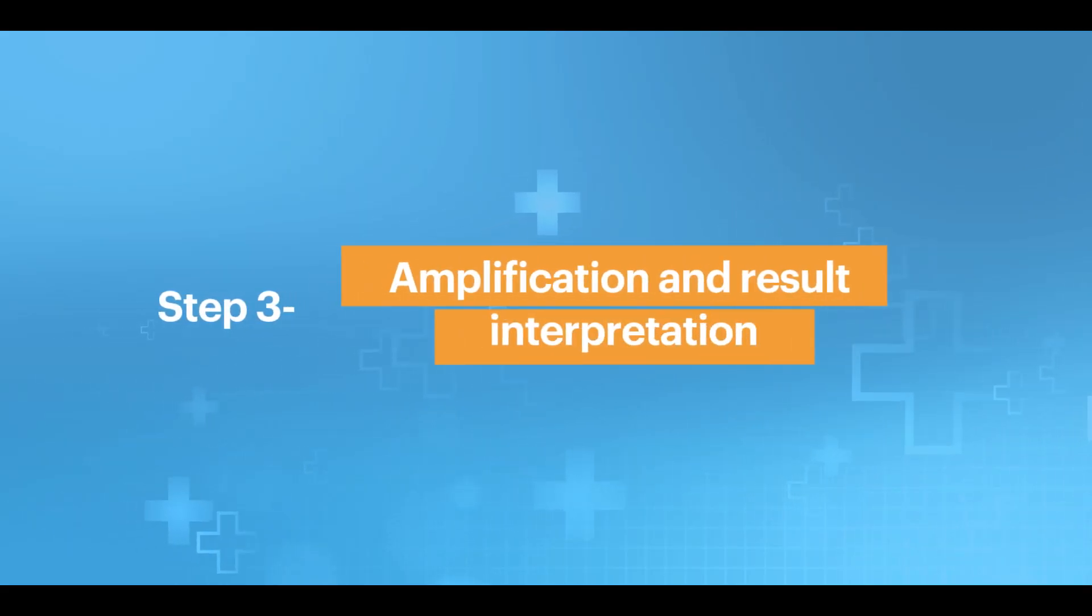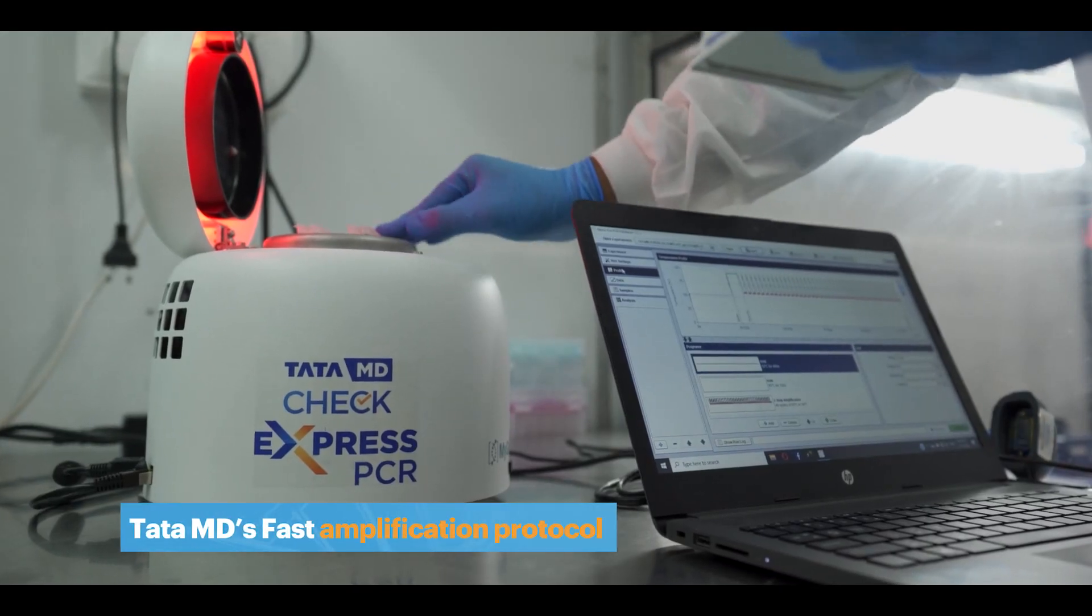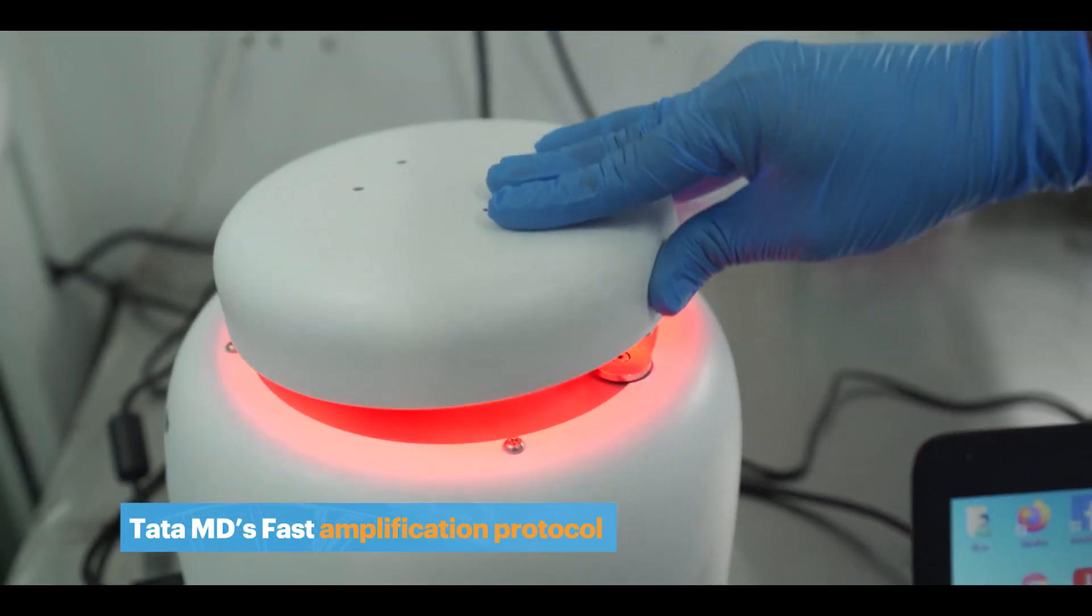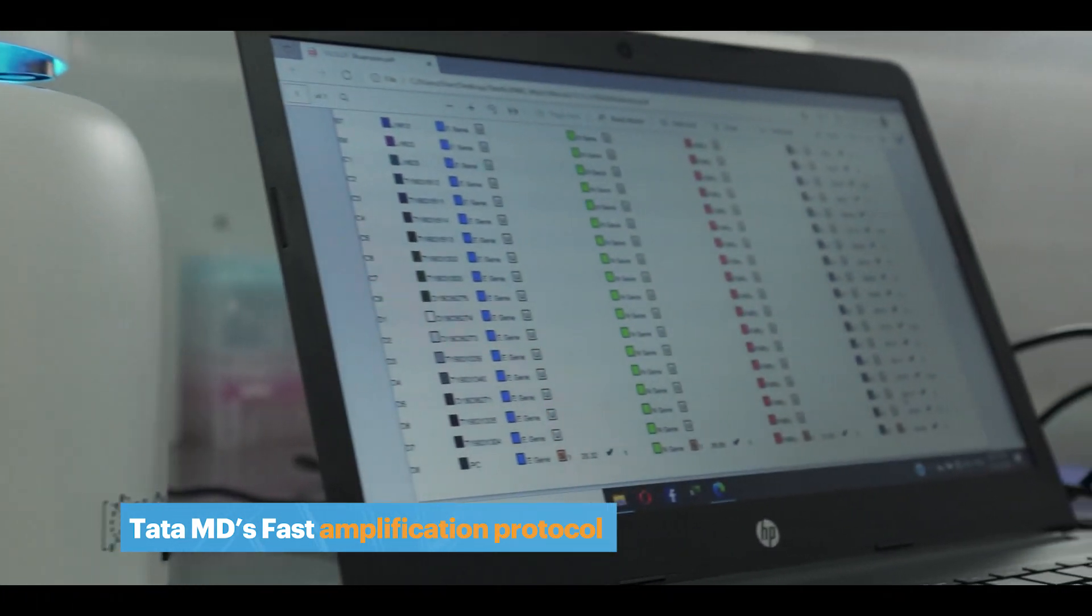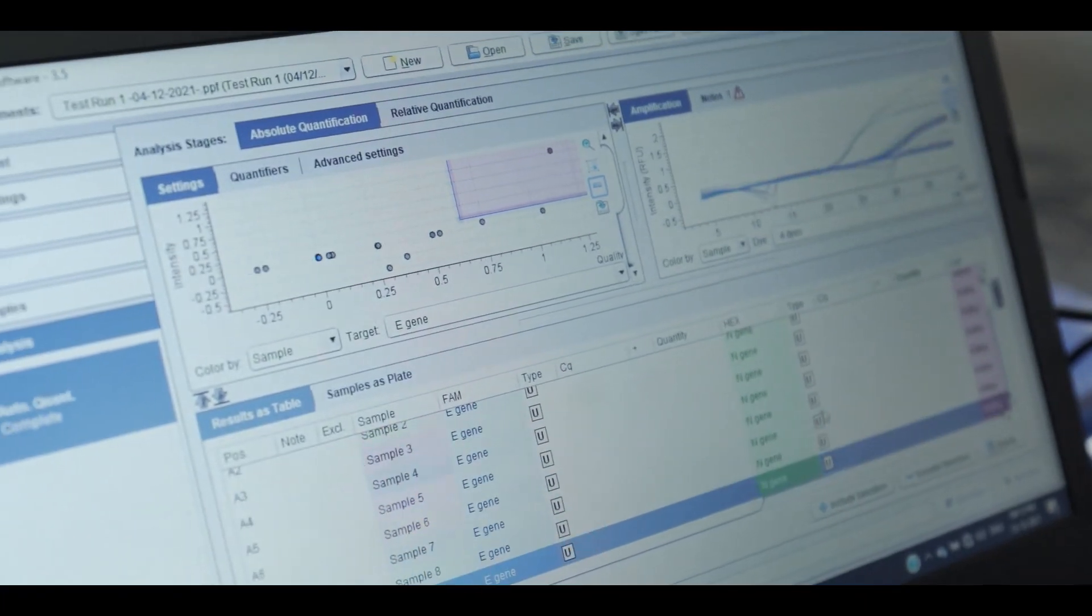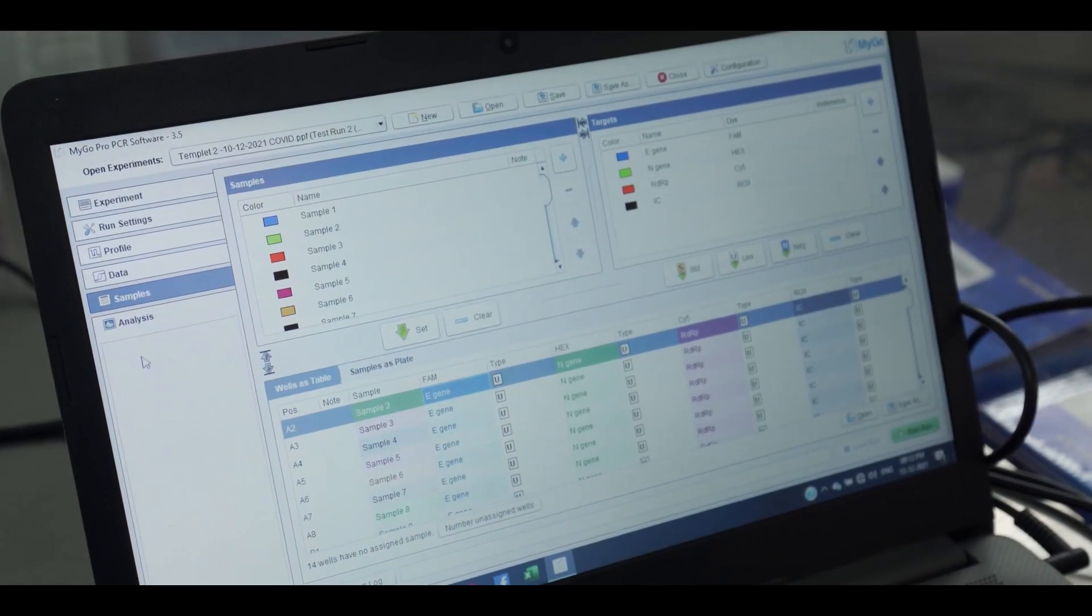Step 3: Amplification and result interpretation. The strip is then loaded into the express PCR analyzer and a pre-programmed protocol is run. In just 45 minutes, results are ready to be interpreted.